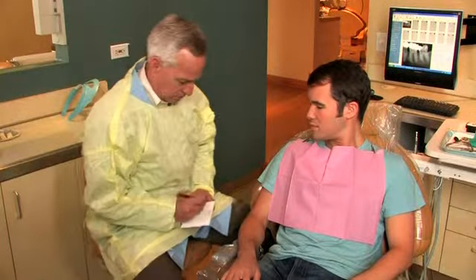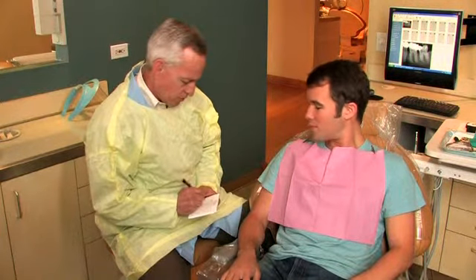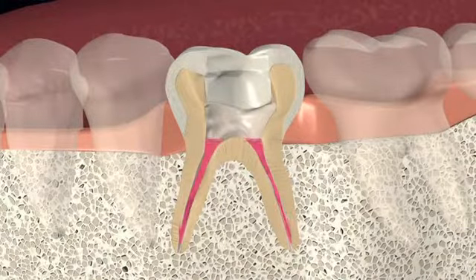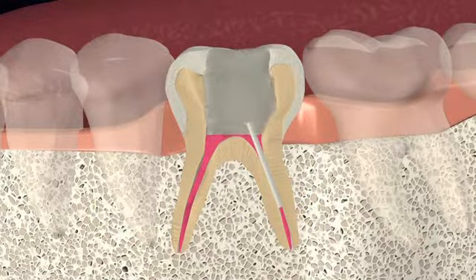If your dentist or endodontist notices the infection has spread beyond the end of the root, antibiotics may be prescribed. As with all medications, use only as directed and call your dentist or endodontist if you notice any problems or side effects. At the next visit, the temporary filling is removed. The root canal is then filled and sealed, typically with a rubber-like material called gutta percha.